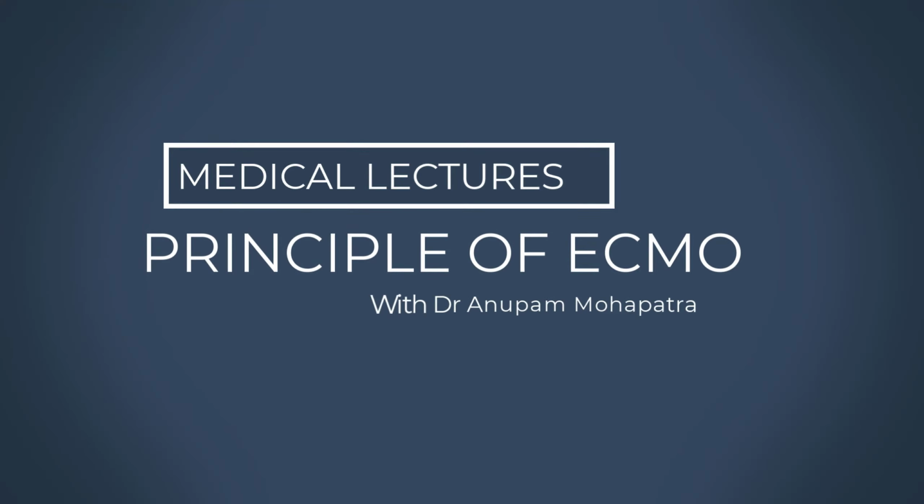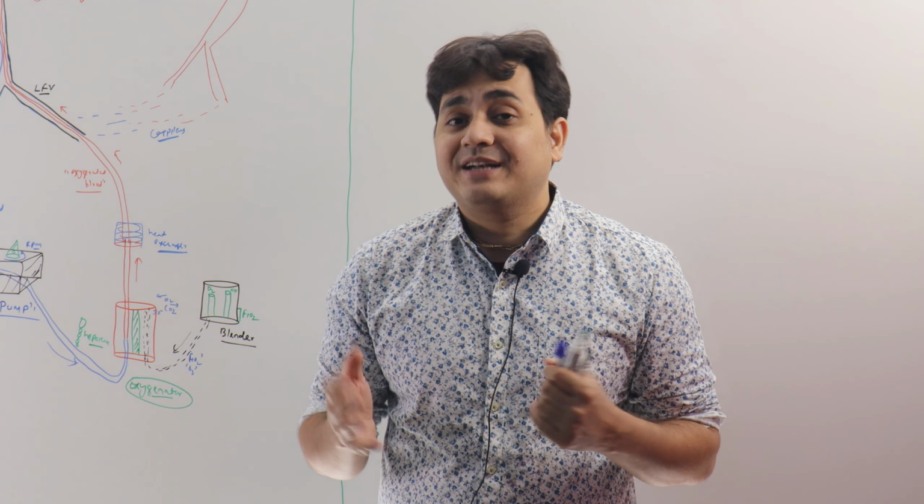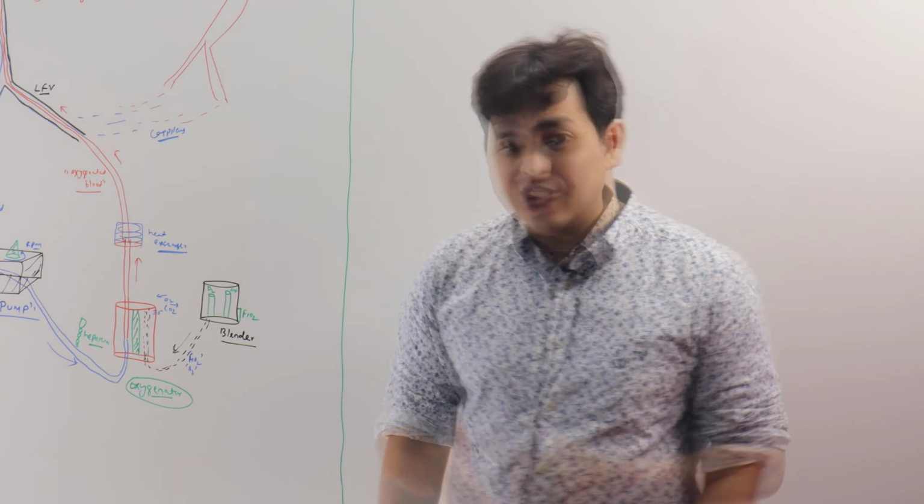Hello everyone, let us discuss today the very popular technique called extracorporeal membrane oxygenation. When you are left with nothing, our ARDS patient is deteriorating, he is desaturating, there is hypoxemia which is refractory to all available methods in medical science that you have discussed till now. We are left with extracorporeal membrane oxygenation, or ECMO. So today we'll discuss the concept behind it, the idea of ECMO, how it works. So let us discuss.